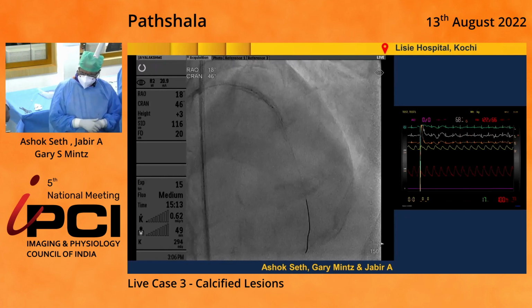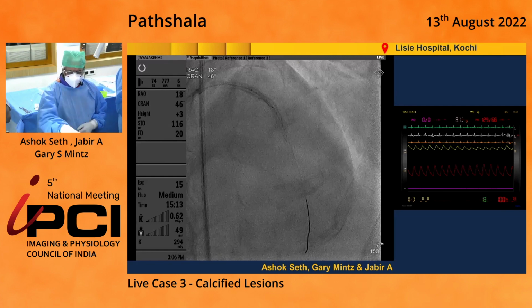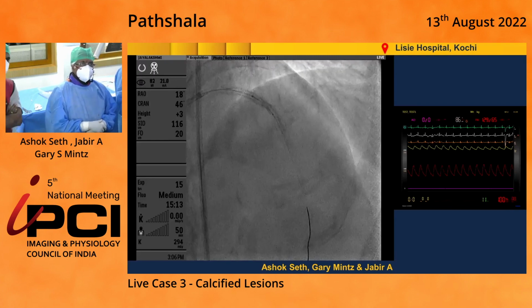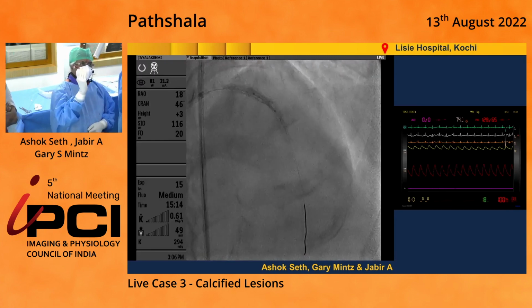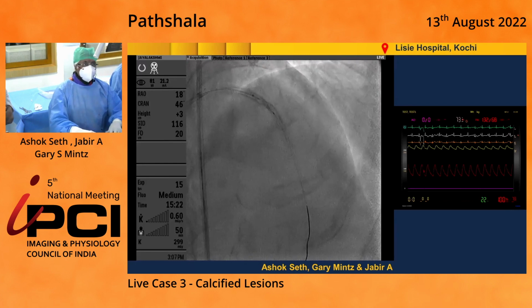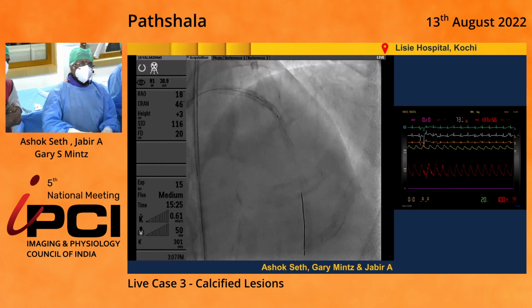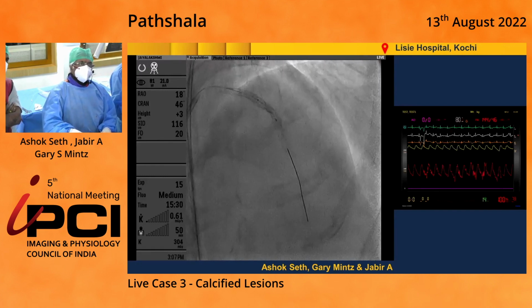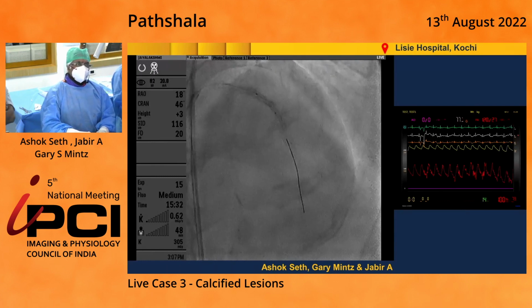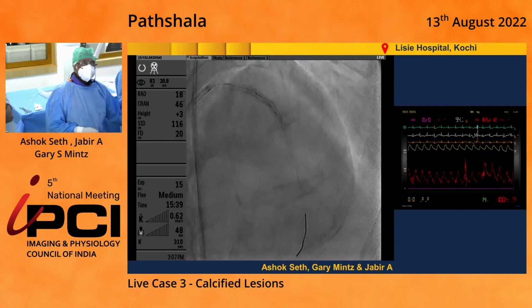So Ashok, sorry, quick question for you. Why put the balloon in the middle of the lesion? Why not just have the emitters right at the site from the get-go? I'm just going to do that. I'm going to put the emitter on the side, the first emitter, and you can see that emitter, which is around, the emitters are 2, 4, 6. So there we are. Okay, here's the emitter coming in, and let's see. Negative, good enough negative? Yes, negative. Okay, so that's more like the emitter on the lesion. Okay, go up.